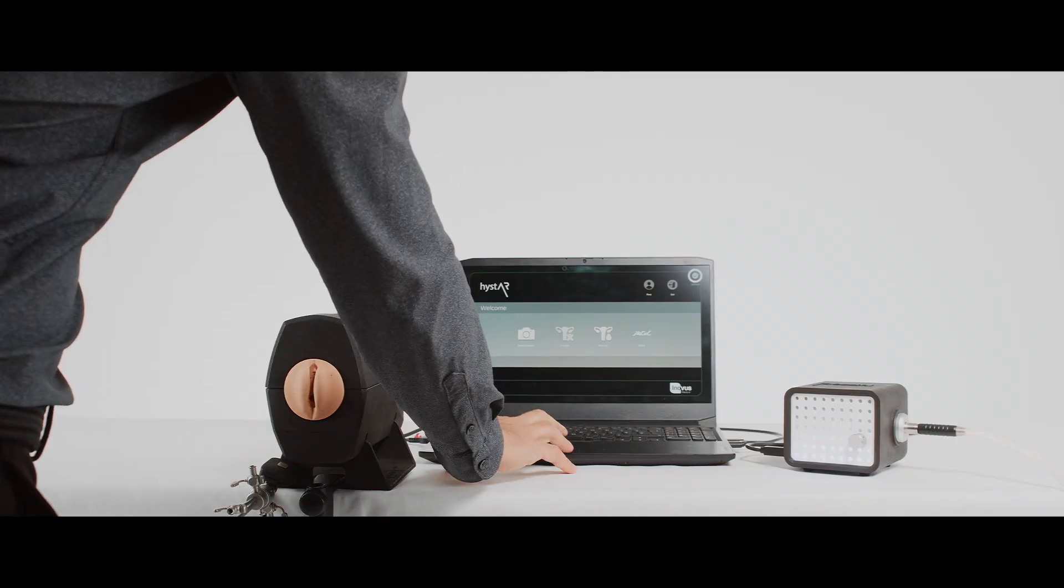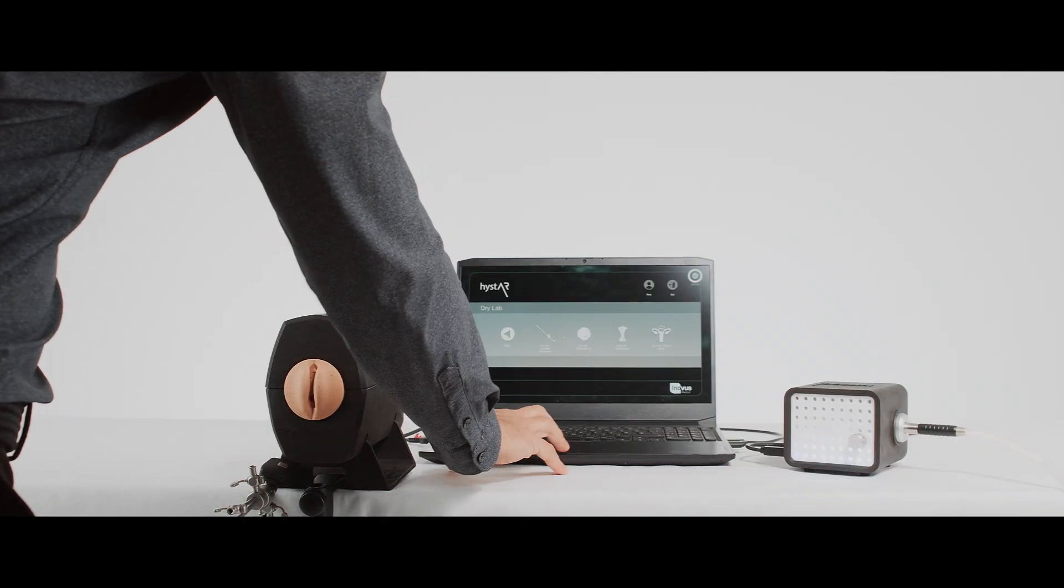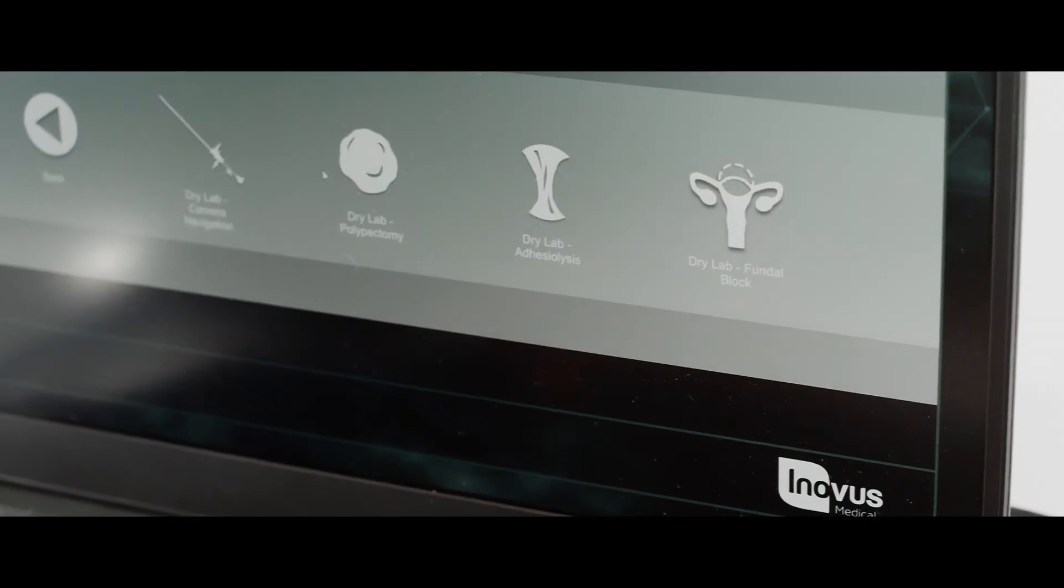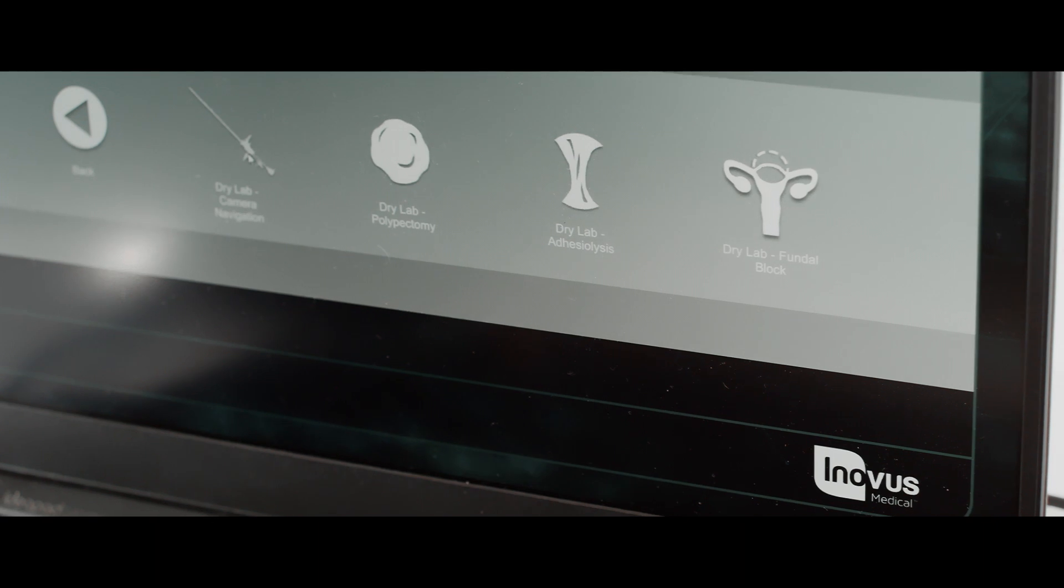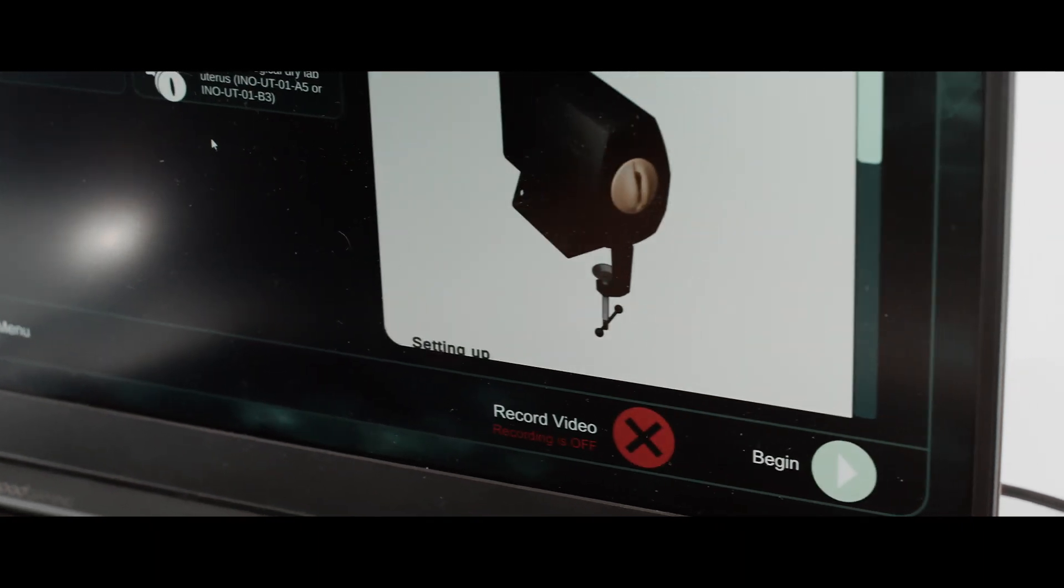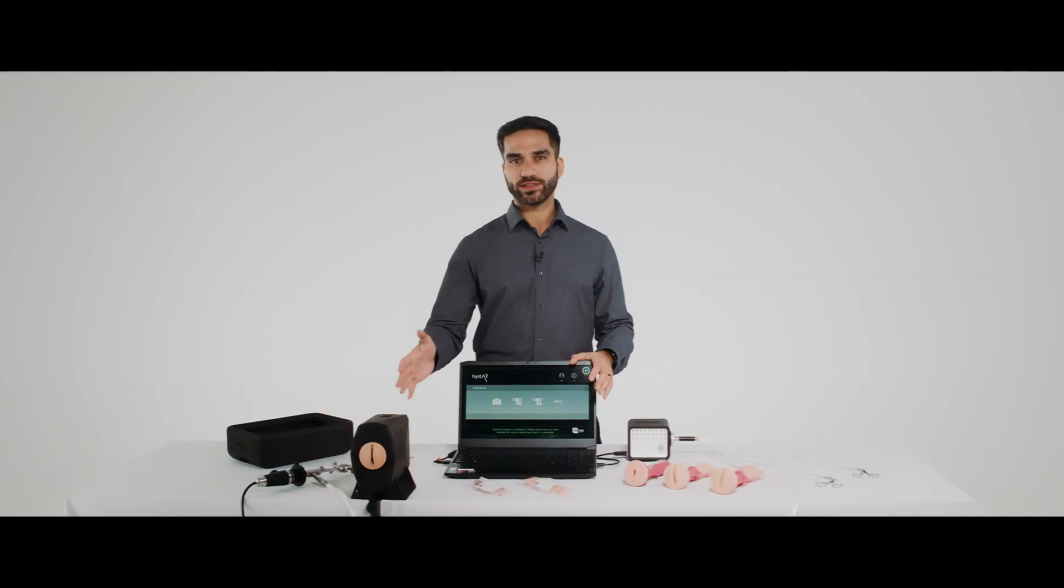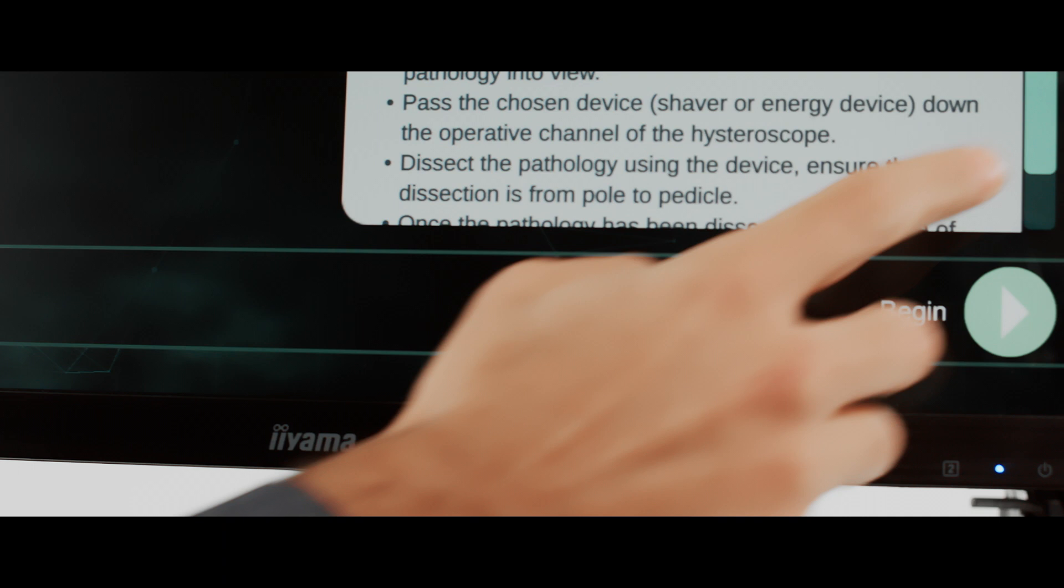To begin, the surgeon will log into the HIST-AR Totem app and select the module they wish to perform. They will then set up the model inside the uterus mounting box.